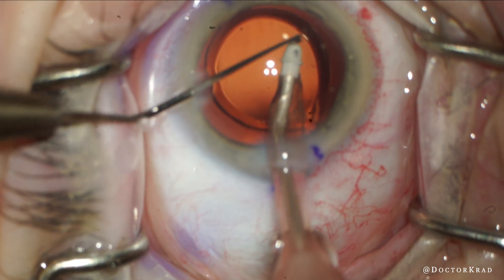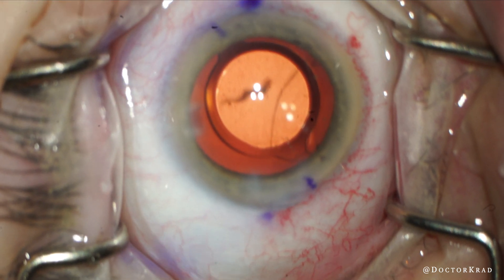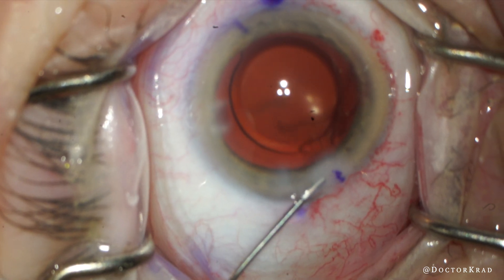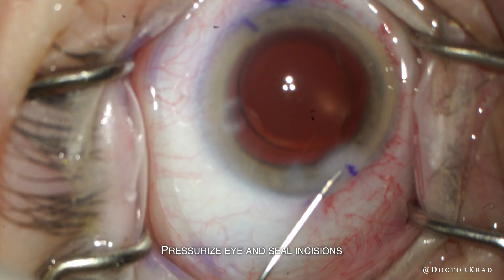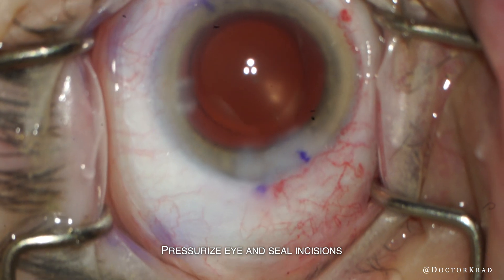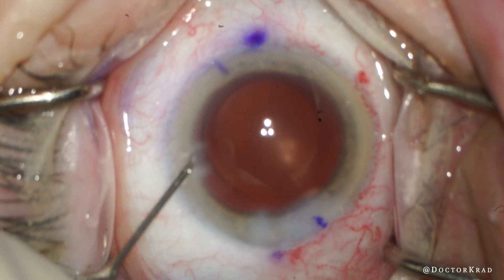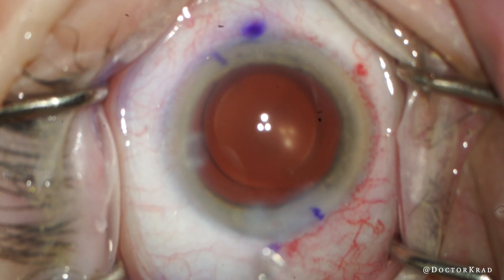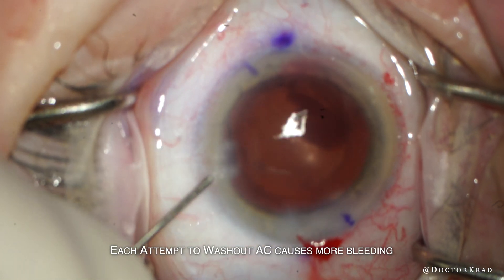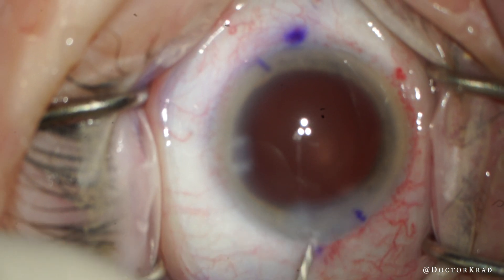So what was that dark peripheral shadow? It appeared for an instant and then disappeared — and here it reveals itself. This is a fairly brisk bleed, so the priority is to seal the eye, pressurize it, and seal the incisions. Through the paracentesis I'll try to wash out the heme from the anterior chamber, but each attempt to wash it out causes more bleeding, and at this point I can't even see the IOL anymore.